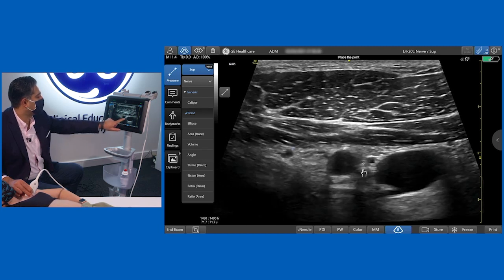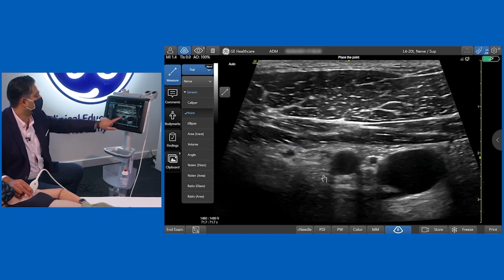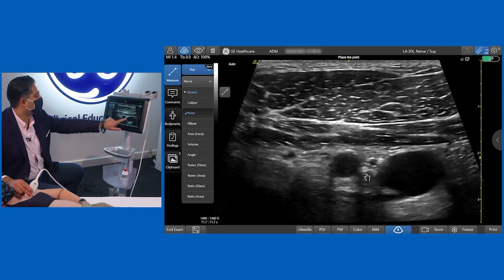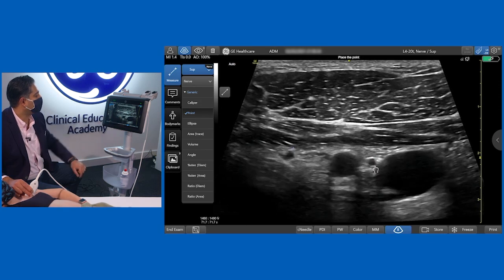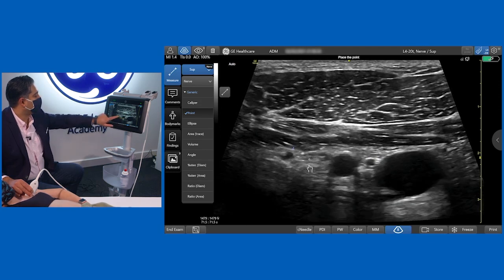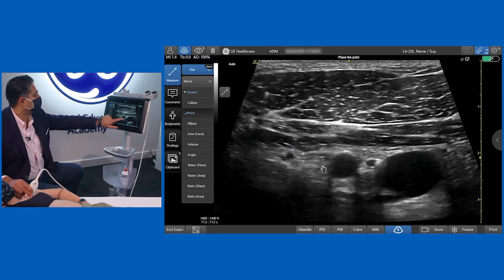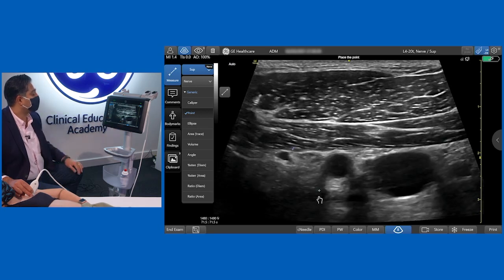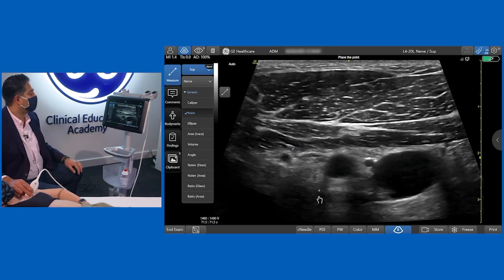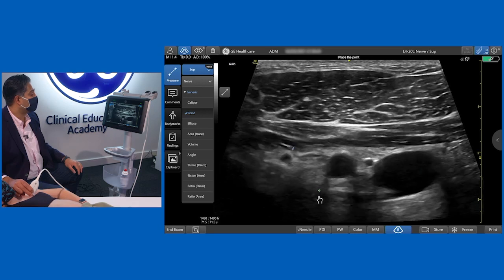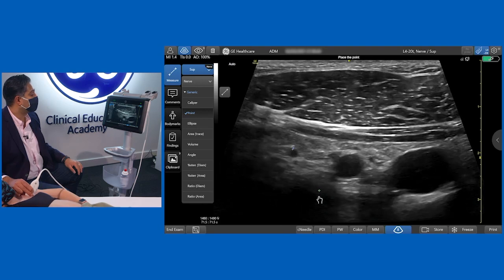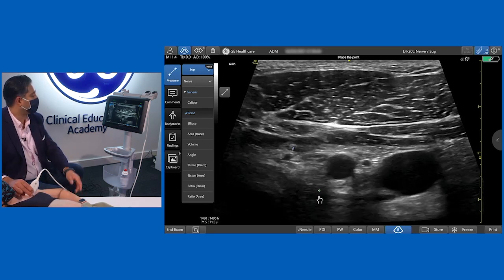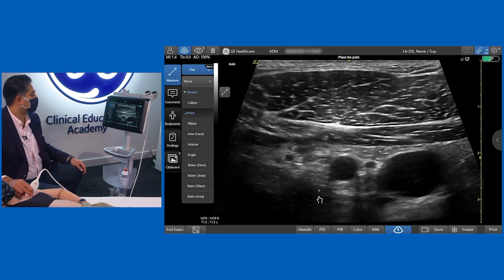That way you get the lateral, posterior, and medial cords covered. You'll need to be careful of the vessels that are lying in the way, but this is a really nice block for upper limb, hand surgery, and elbow surgery — and you can do it with the patient's arm abducted or by their side.